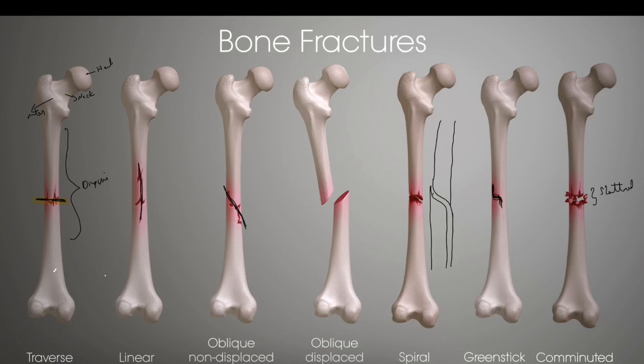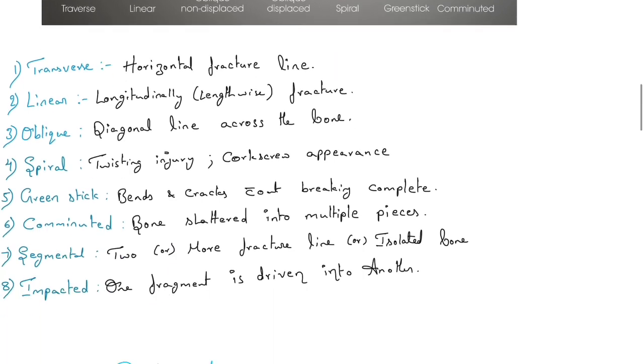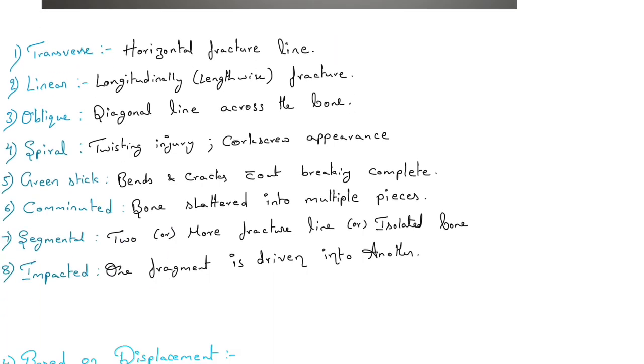After this introduction, I will show you some X-rays. In that X-ray, you can easily differentiate the types of fractures, okay. Next, we are discussing segmental fracture. I don't have an image, okay.